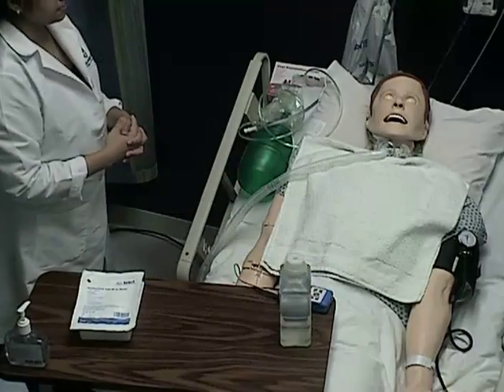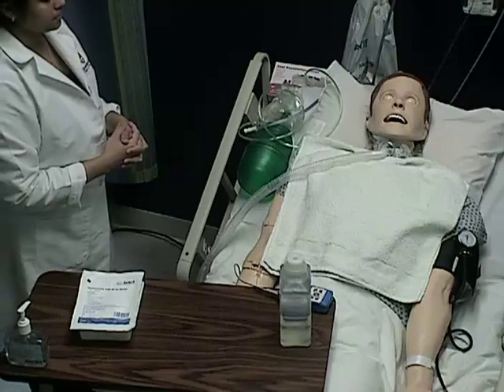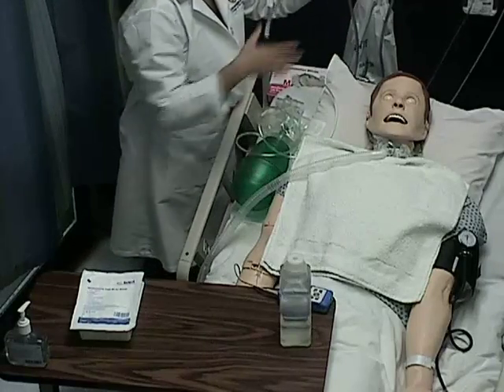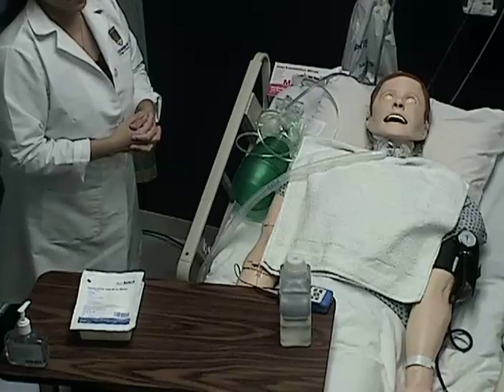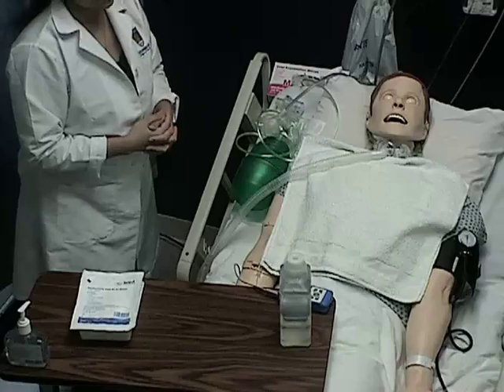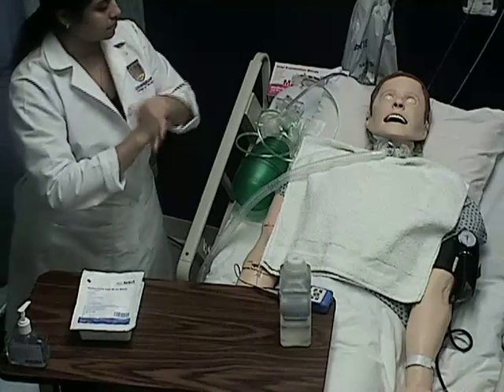Step 3. Implementation. Ensure that all equipment is available and functioning. This includes suction tubing and ambu bag setup. Now you are ready to begin trach care. First, perform hand hygiene and place appropriate PPE.